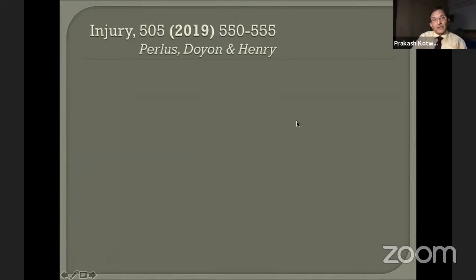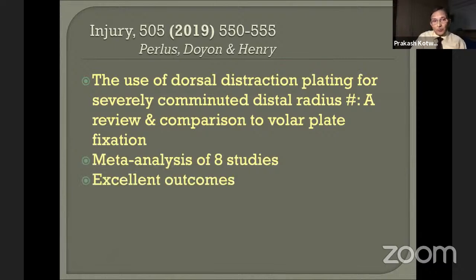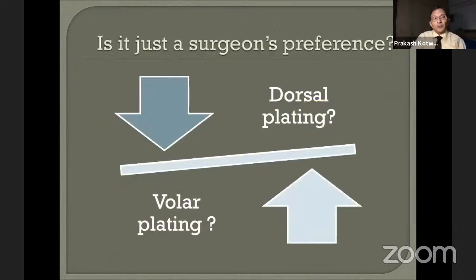And this is a very recent article, 2019, on the use of dorsal distraction plating, and it was a meta-analysis of 8 studies, with excellent outcomes reported, a very low complication rate, and they definitely showed advantages over the volar plating. Of course, the only flip side is that it requires plate removal.